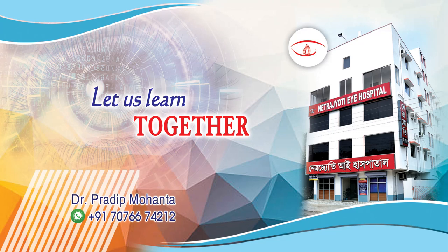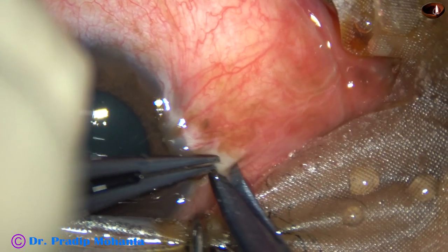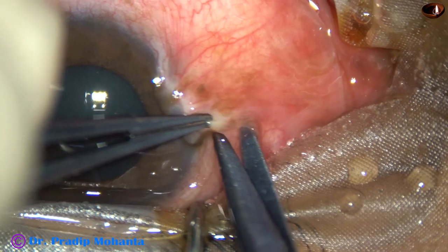Friends, welcome to my workplace at Ranaghat, West Bengal, India. This is pterygium excision with conjunctival autograft. Let us observe this surgery.